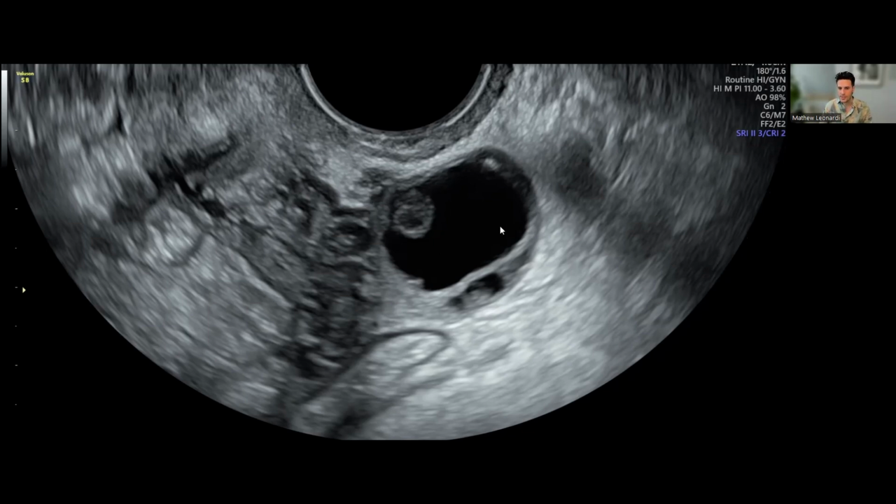Most ovarian endometriomas are actually born at the site of an adhesion to endometriosis on the peritoneum, often the uterosacral ligament. So I would be worried in this case that if and when this ovulates, which it looks like it's imminently going to do, the repair cycle of that follicle rupture could happen at this area right here, in which case you may have active endometriosis at the healing site, causing development of endometriosis within the ovary in a process called invagination. And that is most likely the source of most endometriomas, the invagination process.